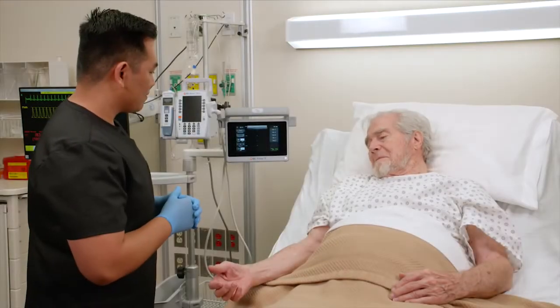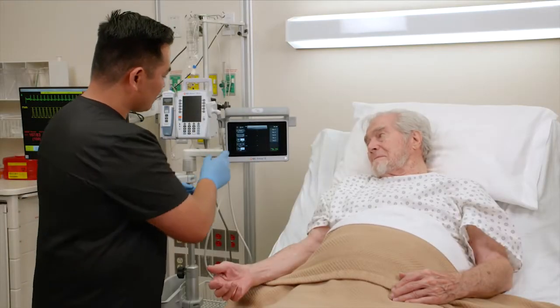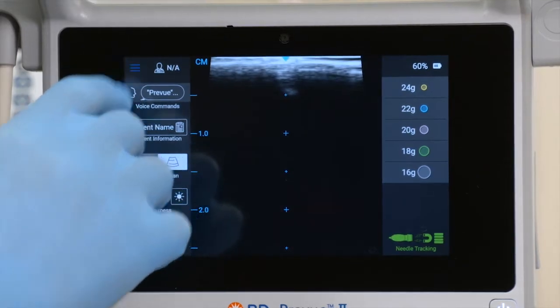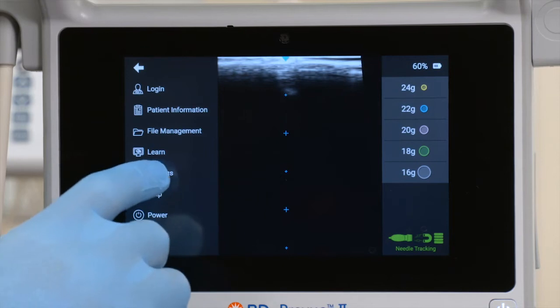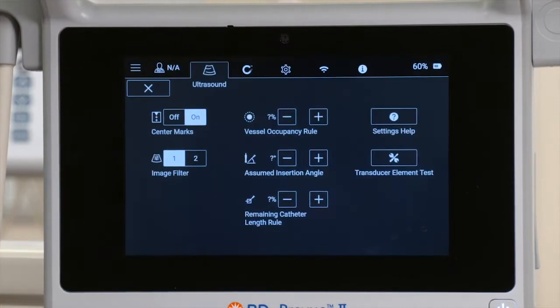To prepare for the vessel assessment, go to the menu bar, select Settings, and then select Ultrasound.